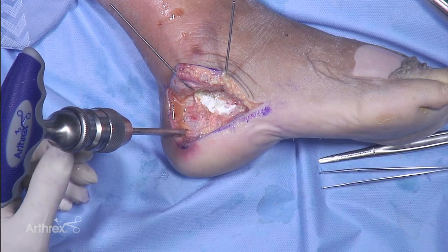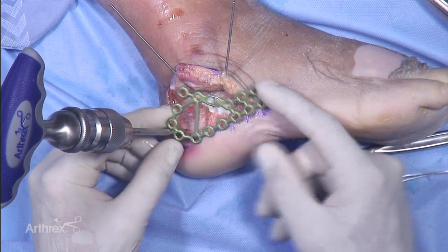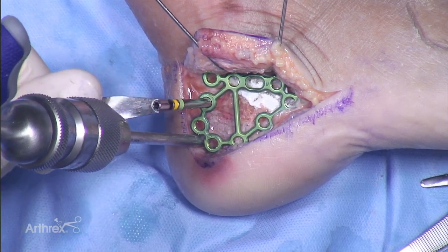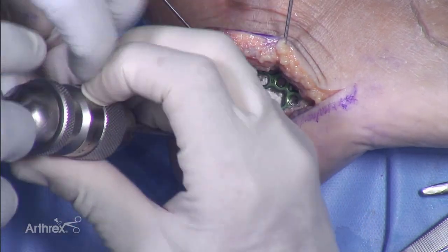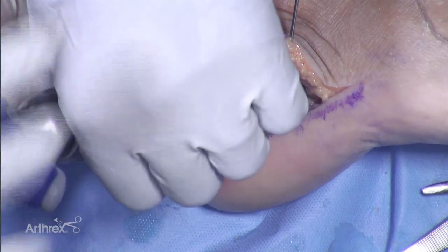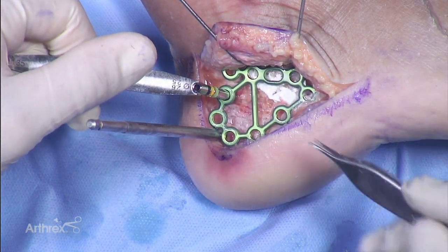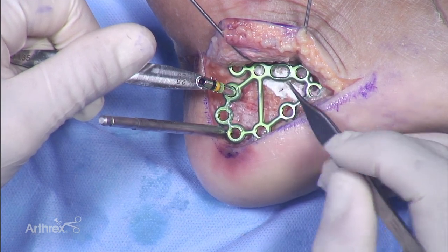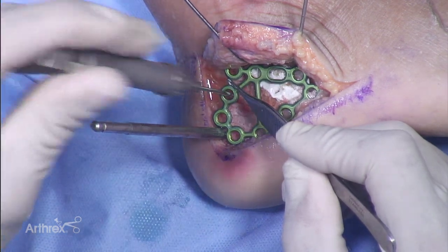For definitive fixation I'll use a calcaneal plate. I'll often get a size I think fits and set an x-ray over it to see how it's fitting. I like to start with a couple of non-locking screws that bring the plate down to the bone — locking screws give excellent support but will not compress the plate against the bone, so I want it down flush and not prominent. I'll drill through and you can notice the plate angle is designed to support the sub-articular region of the subtalar joint. I'll start with one in the back and measure — that measures 32mm.